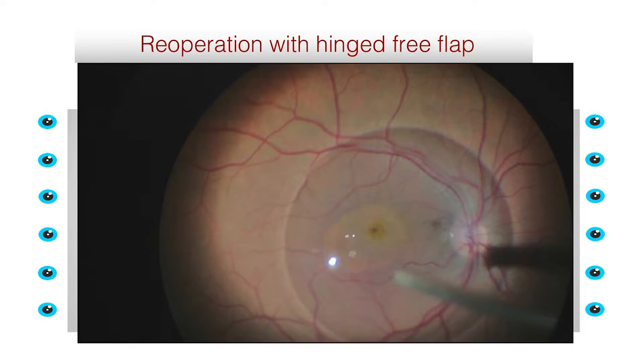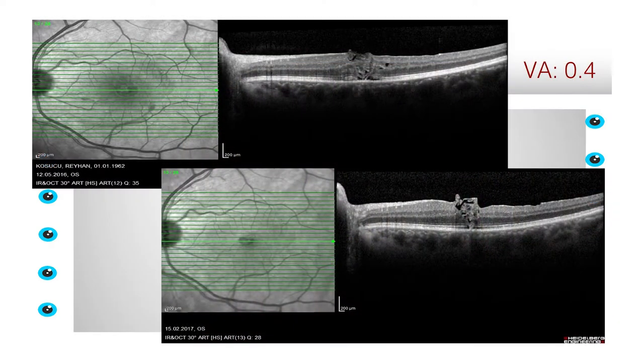As you see here, when you release one end, you put it into the macular hole area and you release the other end so that it doesn't move freely. The manipulations are much easier with this technique, and you have to be insistent on, again, taking the fluid around the PFCL first and then the PFCL so that you don't lose the free ILM flap. I don't lay it over the hole, but into the hole, as you see here. And you can see that the hole could be closed after surgery.